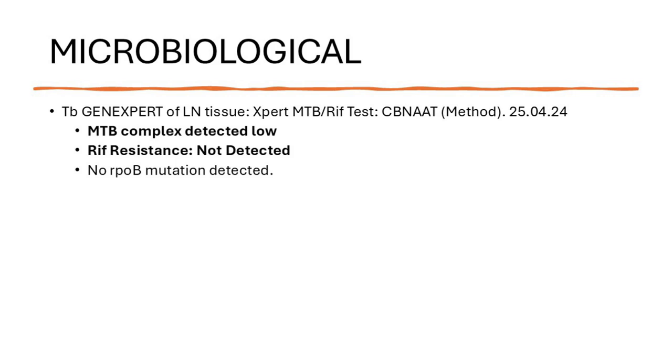This time, luckily, we could isolate the MTB complex. It was detected. The TB Genexpert picked up the MTB complex, although it was low. Rifampicin resistance was not detected. So now this is in April.